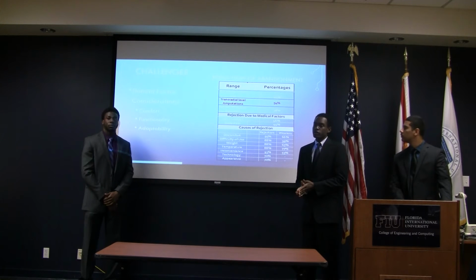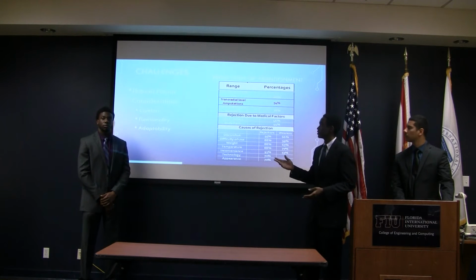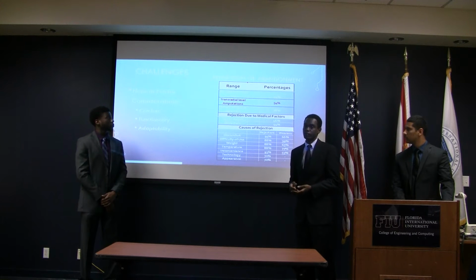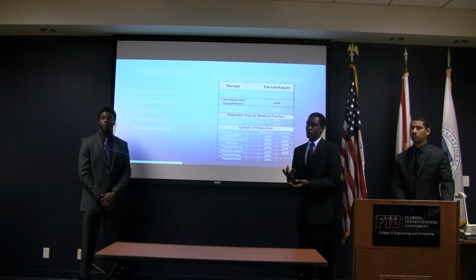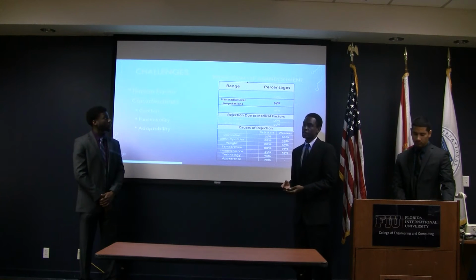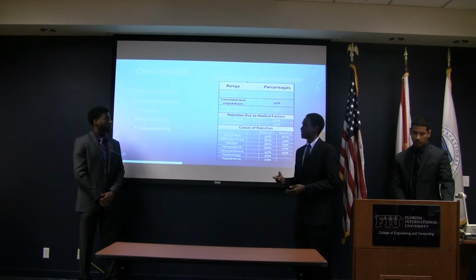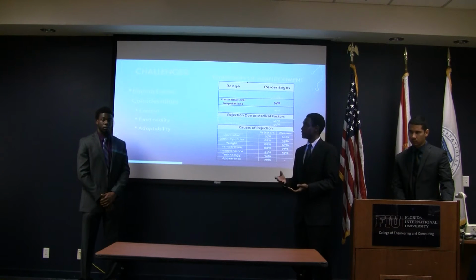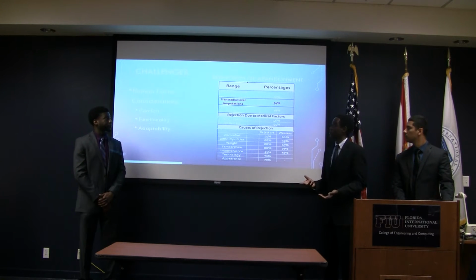Now, taking on this project, there are several challenges that we have to be prepared to encounter. Most of these challenges are human factor considerations under the category of comfort, functionality, and adaptability. Comfort as far as how willing are they to bear a prosthetic through an entire day? Functionality, how much does the prosthetic enable them to carry out everyday tasks? And adaptability as far as how intuitive it is to actually adjust a prosthetic as the child is growing. Now, another major challenge is to reduce the causes of abandonment.